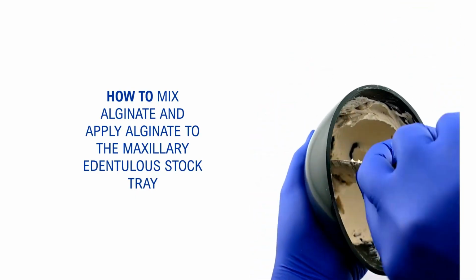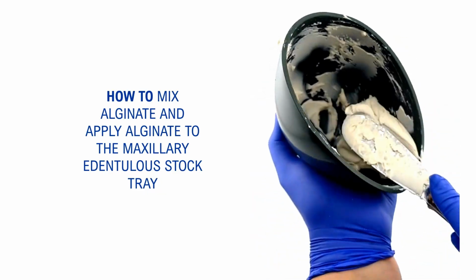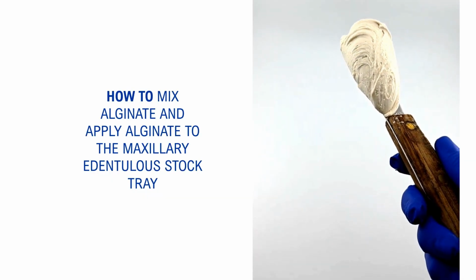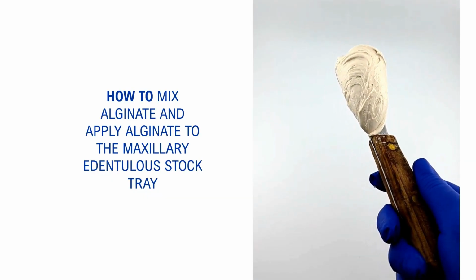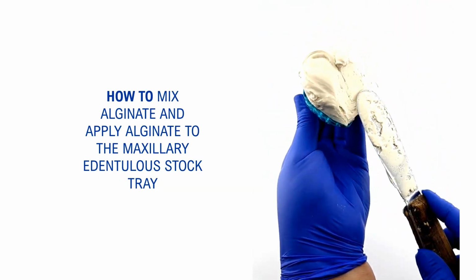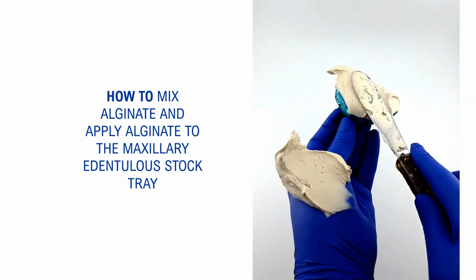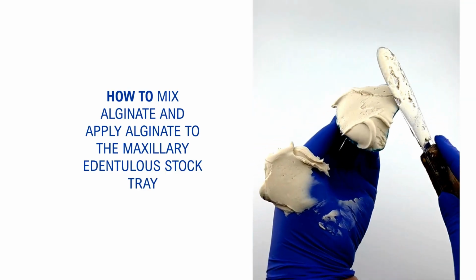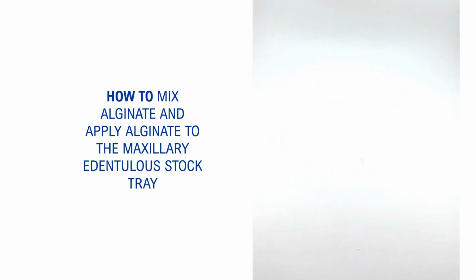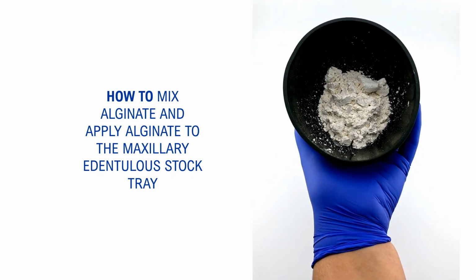So this is a regular setting time of alginate, so you don't need to be working too fast, so you have some time here. You're going to grab all that alginate from the sides of the bowl and put everything in your spatula. Get your tray. You're going to slide all of that alginate in one movement towards your tray. Make sure you're applying some pressure so it fills in completely, and some of that extra alginate will stay on your other hand. You're going to need that in just a minute.